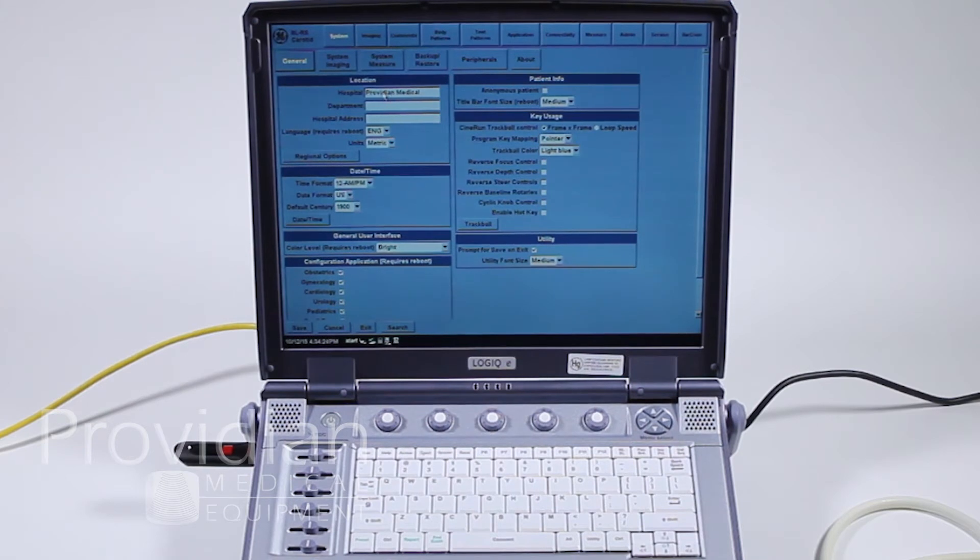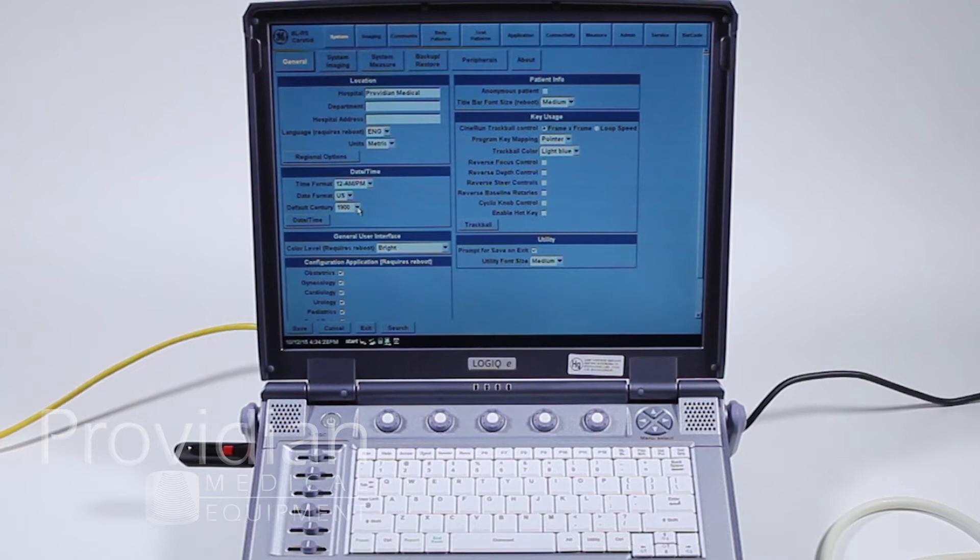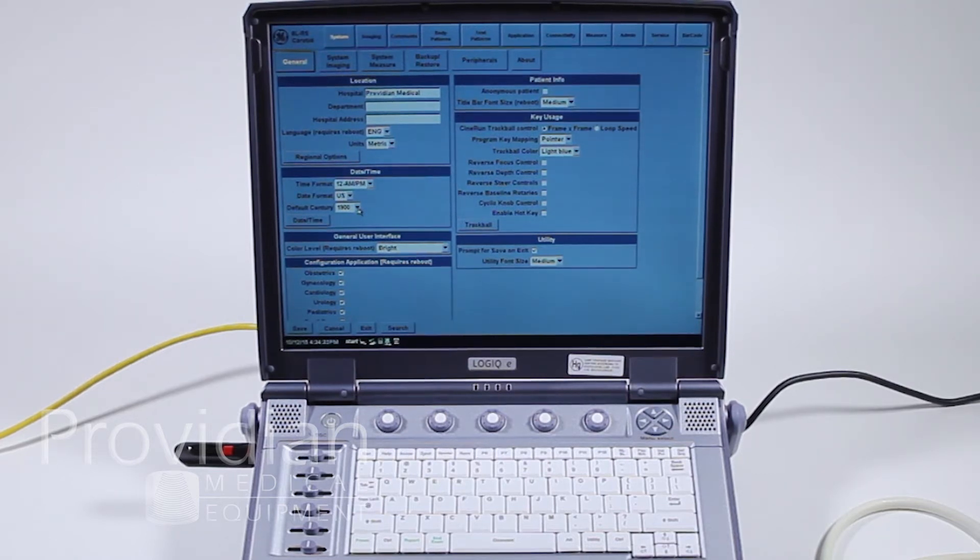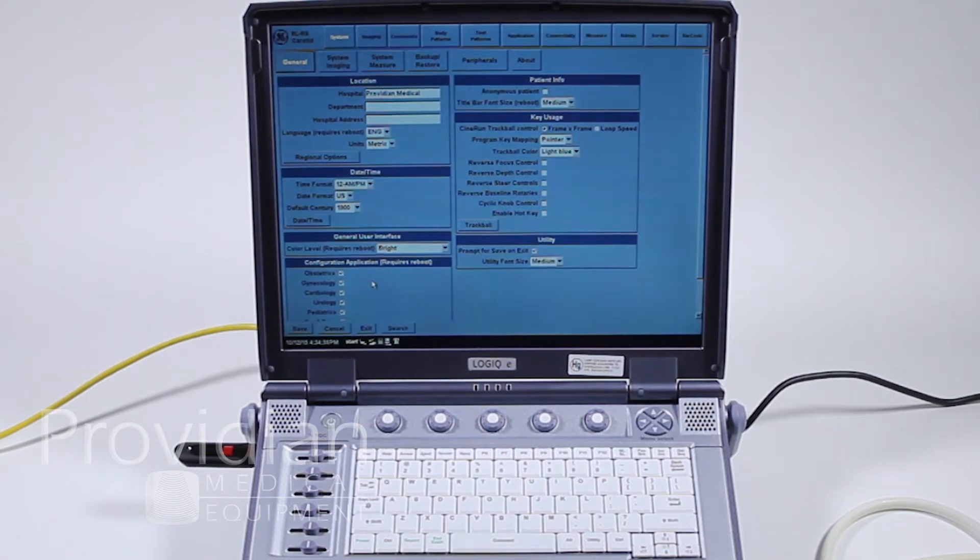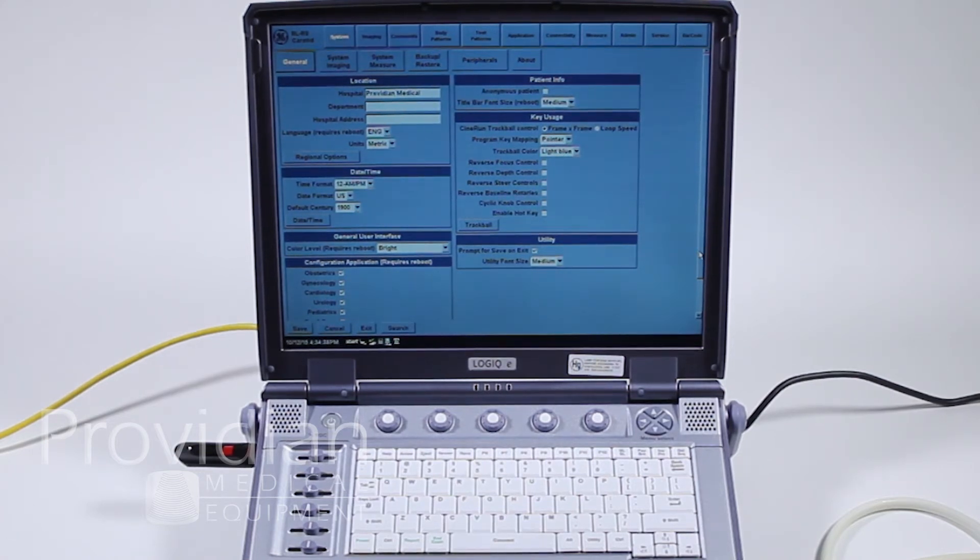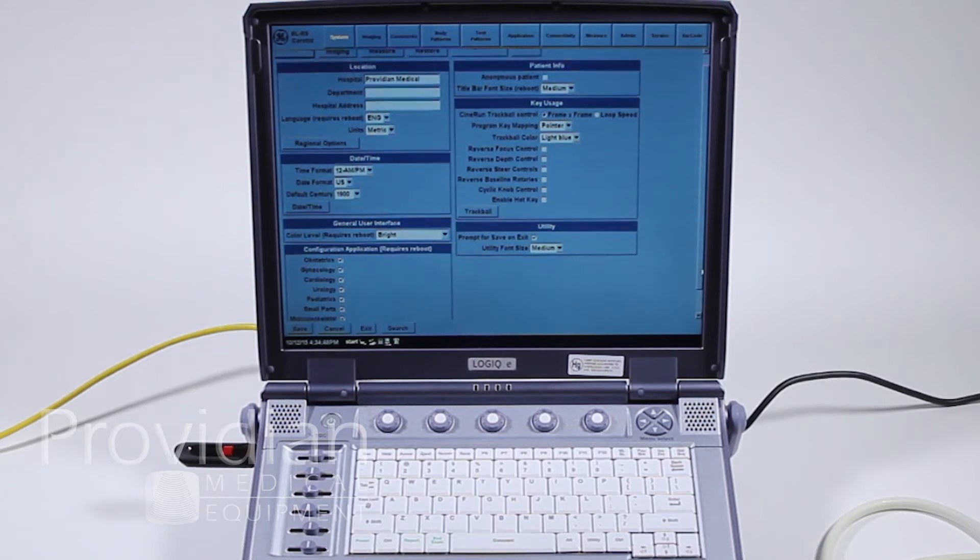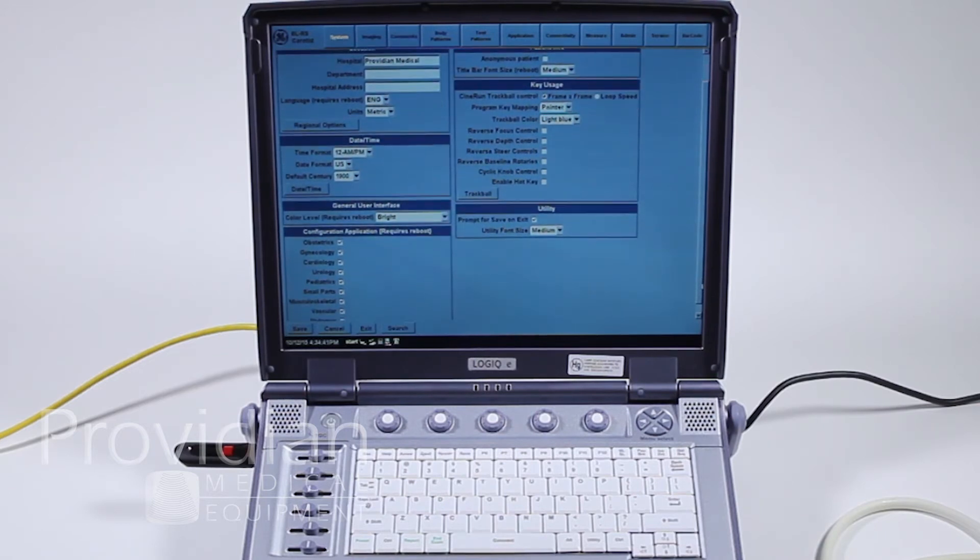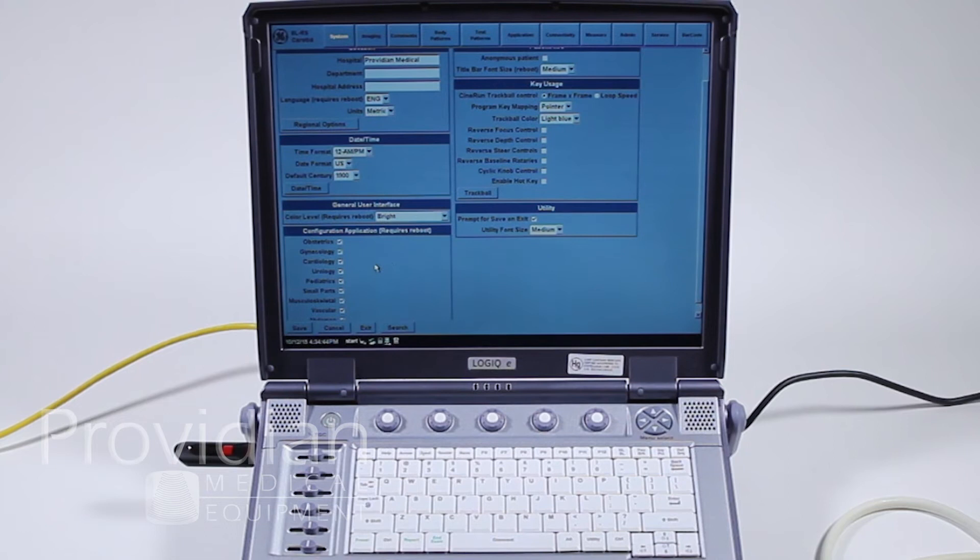So here you will put in your hospital name, change the date and time. This default century is saying when you enter a patient's birth date, you want it this century or the last century. Applications, if you don't want all the applications to show up in that Presets tab when you choose your Probe and Presets, you can remove those here.